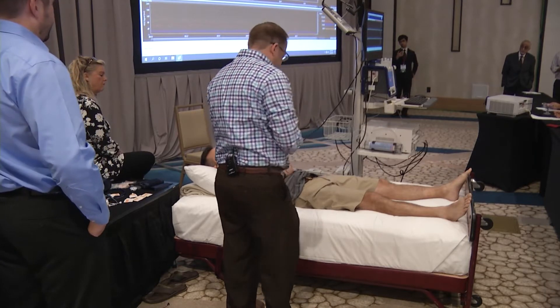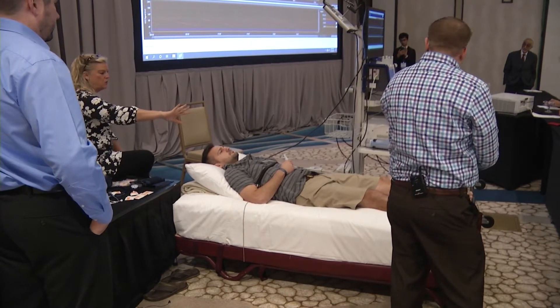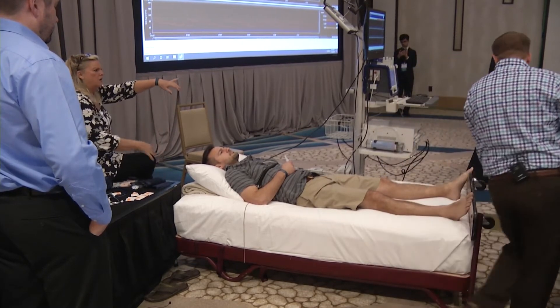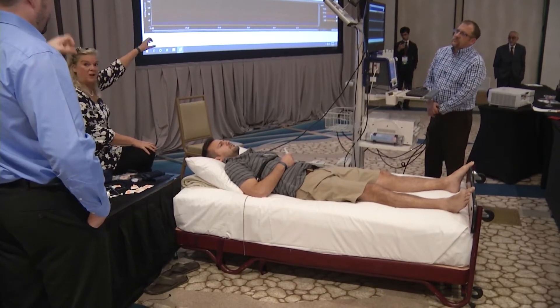Any questions? And again, you want your feet muscles and toes not pushing against the floorboard. Also tell them to keep this arm relaxed. A lot of people will bear down because it's hard to do — making a fist, or bearing down in the arm.